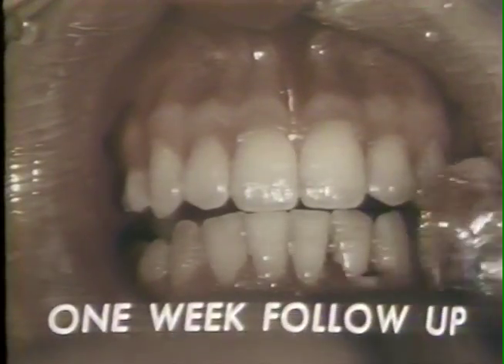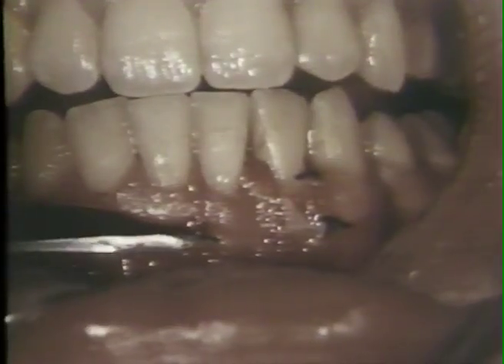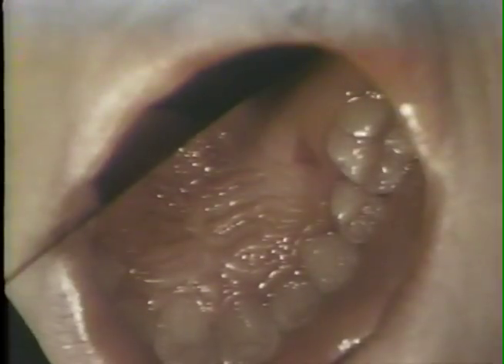One week post-operatively, the dressing is removed. There is some debris on the wound surface. The sutures are carefully removed. After the wound has been cleaned with sterile saline solution, a new surgical dressing is placed over the area of surgery.